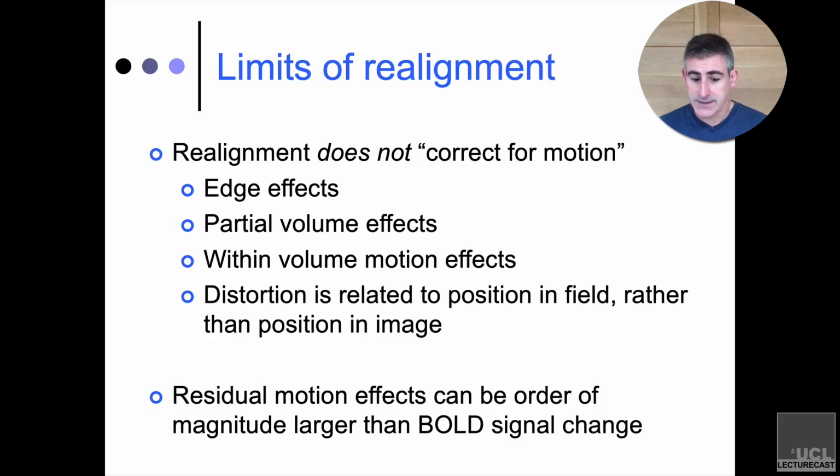And I've given you an example of that already with edge effects, right? Somebody moved their head from one spot to another spot, and as a result, I have to take in some data from outside of my field of view. Well, I can't correct for that. I didn't collect the data. There's no way I can make up what those data could have been had I collected them, right? There's just nothing that can be done in that case. And those are edge effects.